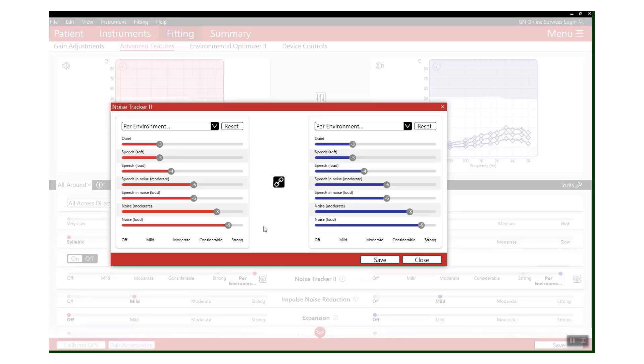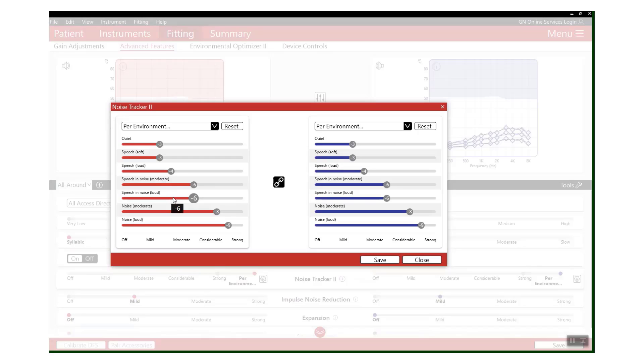So in this case, all we need to do is increase the noise reduction that we want to apply in the same two sliders that we've previously increased the gain for - so speech in moderate noise and speech in loud noise. Again, you're only going to want to do this by maybe two to three dB so that it's not a jumpy change and it still feels like a nice and smooth transition.